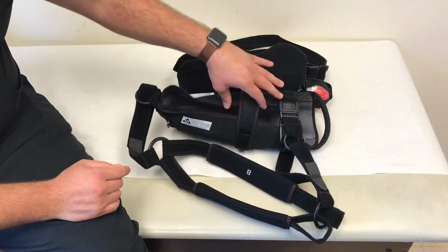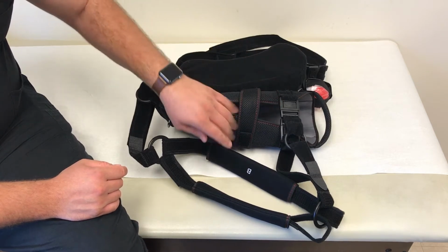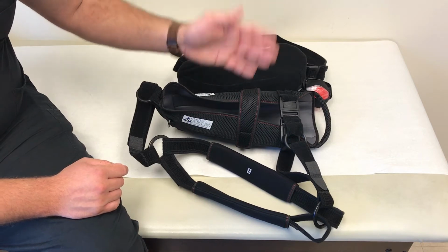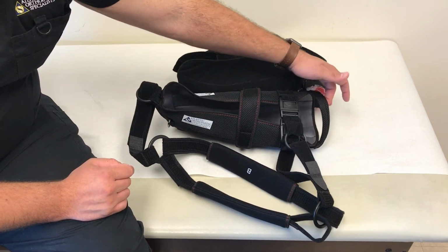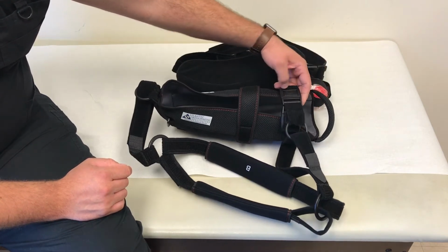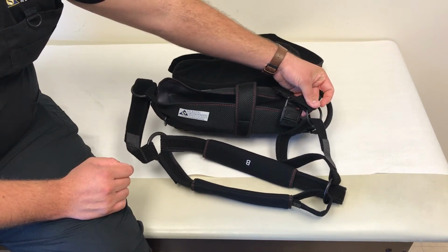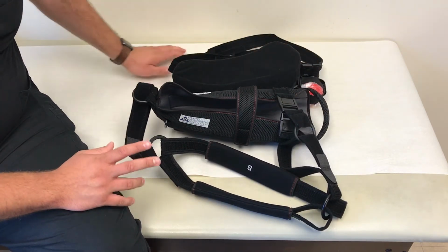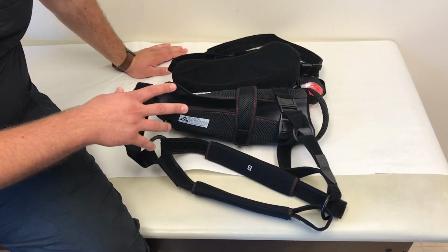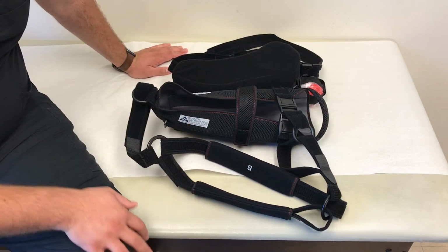On top of that, you have the sling arm holder strap, which will help you keep the arm in the sling so it's not raising up in the sling, as well as the thumb strap that goes across the front of the sling. You have the 2 clips to the DonJoy Ultra Sling IV, which really make this extremely easy to use. And once you understand that those are the key components of the sling and remembering how to reapply it, you're really on your way to making this very easy.